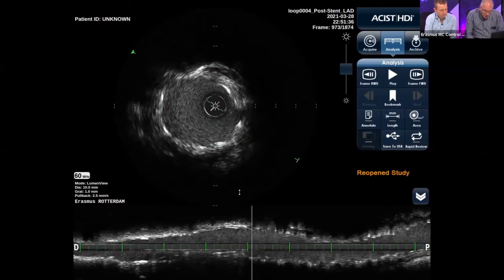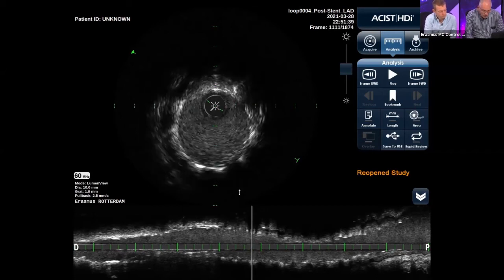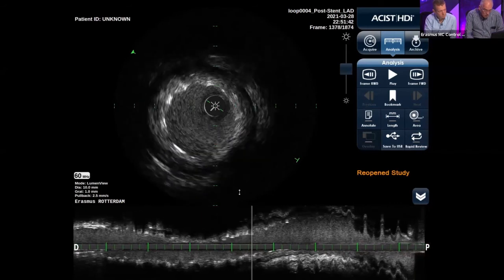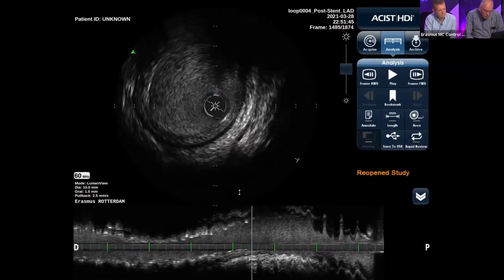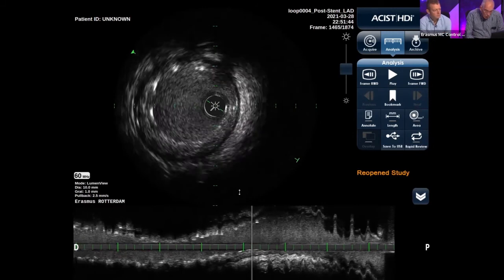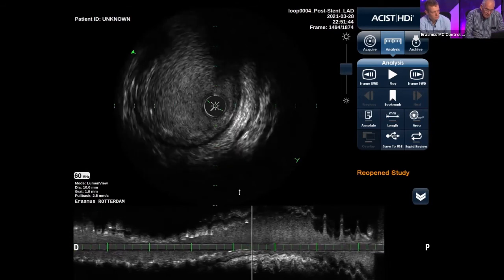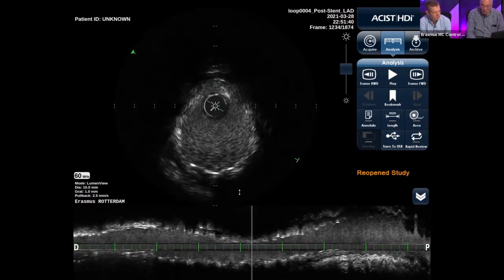Well, in the meantime, we saw that the stents are well opposed. There's still tissue protrusion, or thrombus protrusion in there at 5 o'clock that we didn't remove. So we have now the proximal stent. It's well opposed, especially if you have a vessel size of 4.5, then it's important that you do a good post dilatation. The edges are always notorious for malposition, but here you also see that the ostium of the LAD is covered and the stent doesn't overlap the bifurcation with the circumflex. Excellent. So I think this is a good result. I agree, at least anatomically in this case.